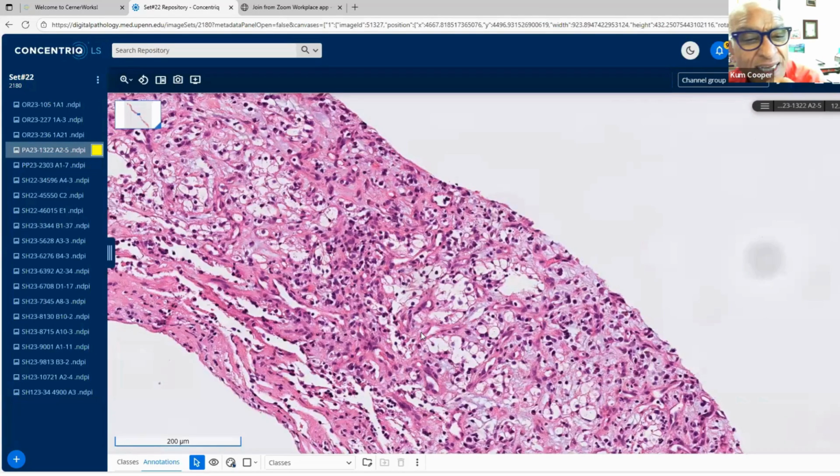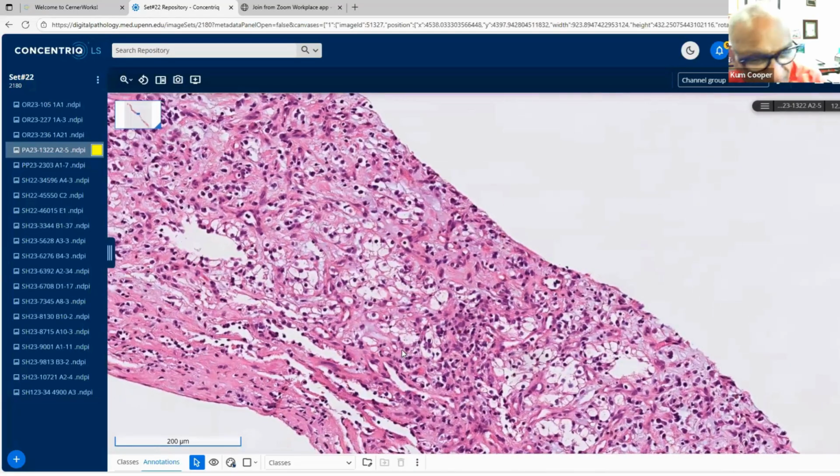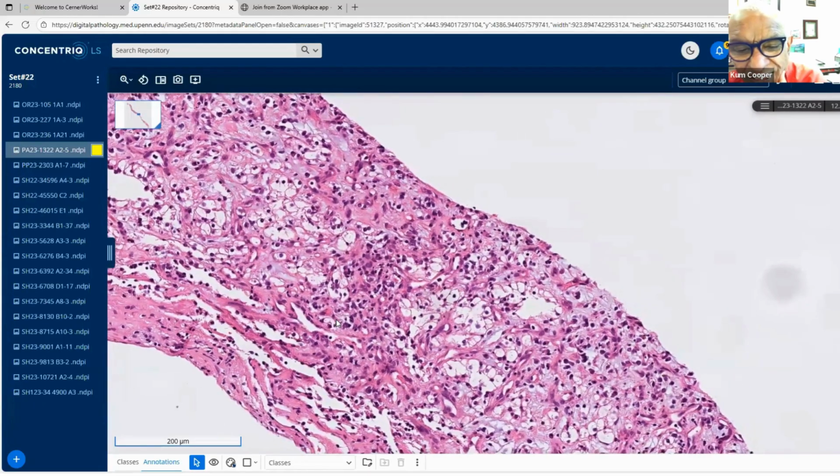And these are clearly epithelial islands. These are Pax8, and the stains I like to do when I'm thinking about a clear cell carcinoma are Pax8, keratin, CK. Well, I don't necessarily do CK7/CK20 because they're typically negative, but I like to do carbonic anhydrase 9, CA9. I like doing that, so that's my go-to panel for renal cell carcinomas.